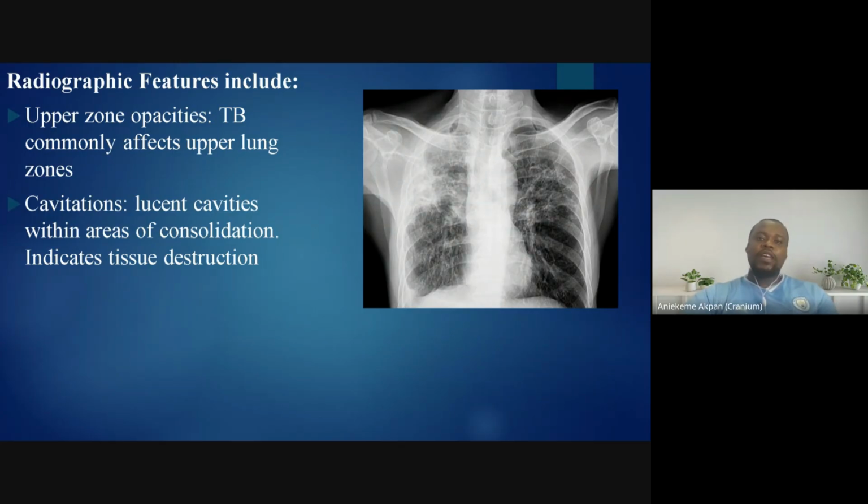We also say we have miliary tuberculosis, though our concern here is not miliary tuberculosis, because miliary tuberculosis more like runs in the blood. It can go anywhere in the body. You can have it in your testes, the liver, the spleen, the ovaries, and the rest. So pulmonary tuberculosis is mostly located in the upper zones or the upper lobes of the lungs, because these areas are oxygen concentrated. I don't know if I've answered your two questions.